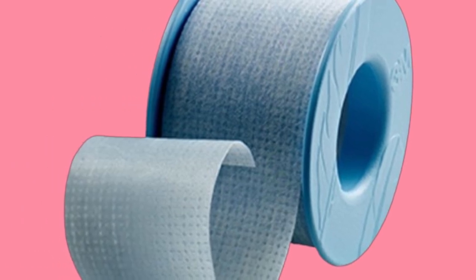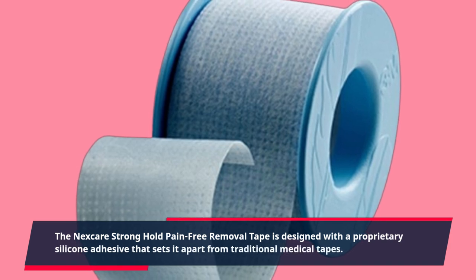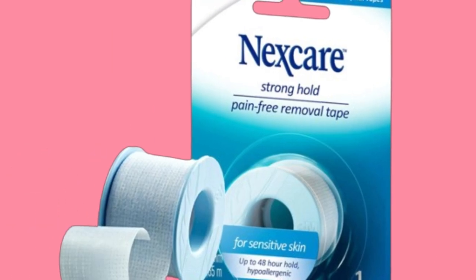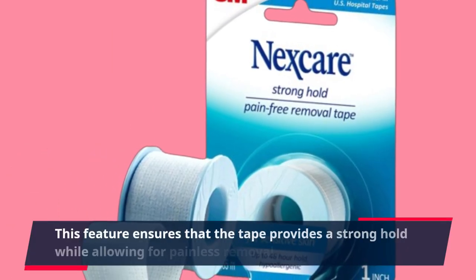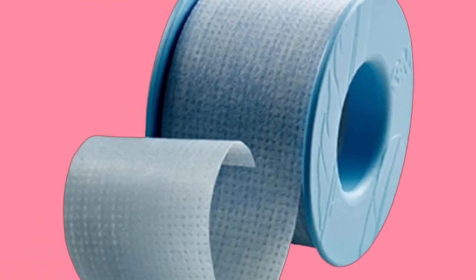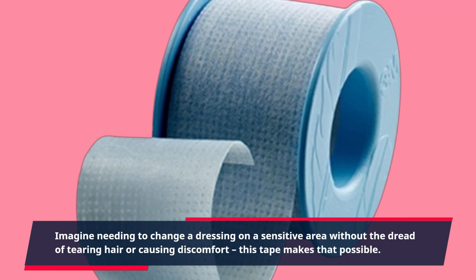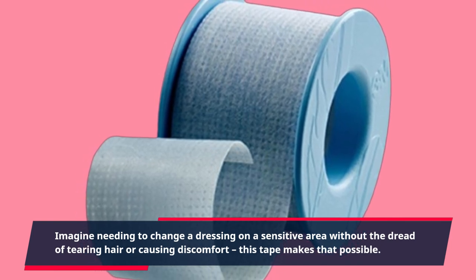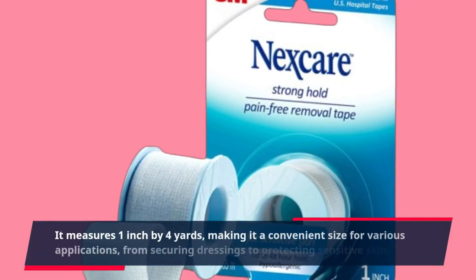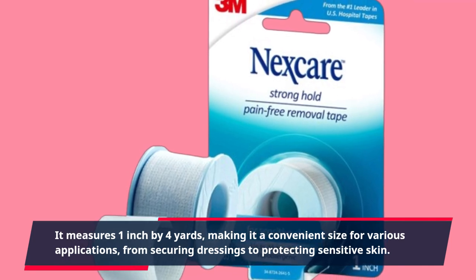The Nexcare Stronghold Pain-Free Removal Tape is designed with a proprietary silicone adhesive that sets it apart from traditional medical tapes. This feature ensures that the tape provides a strong hold while allowing for painless removal. It measures 1 inch by 4 yards, making it a convenient size for various applications, from securing dressings to protecting sensitive skin.